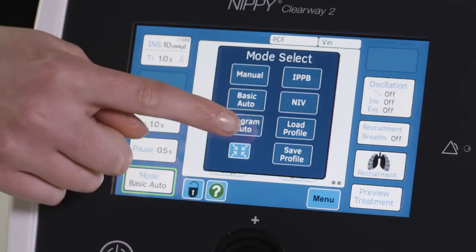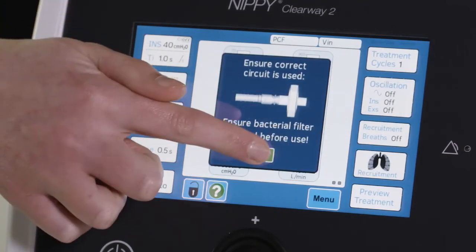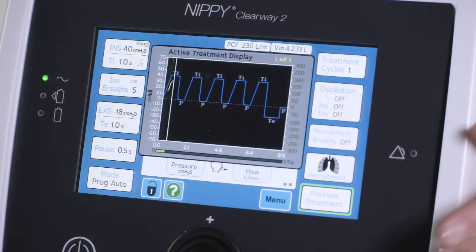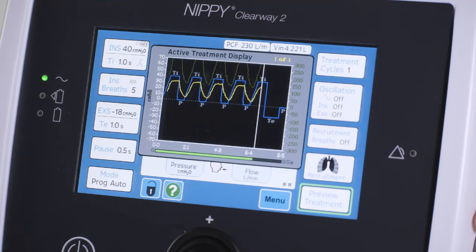Program mode allows clinicians to set a specific number of insufflations before an exsufflation, as well as a specific number of exsufflations with a pause between each repeated insufflation and cycle. Other features such as allowing patients to trigger the insufflations can be applied in this mode also.